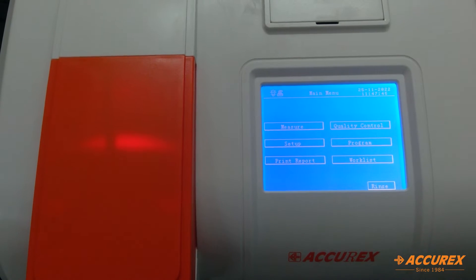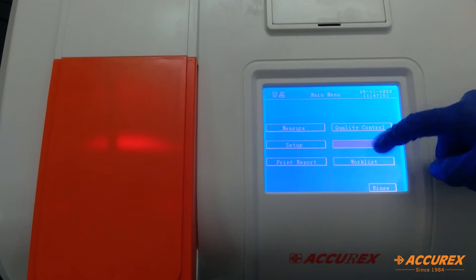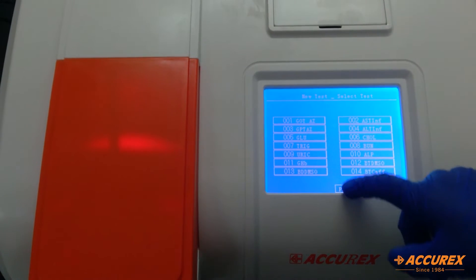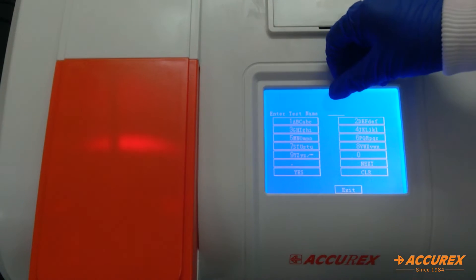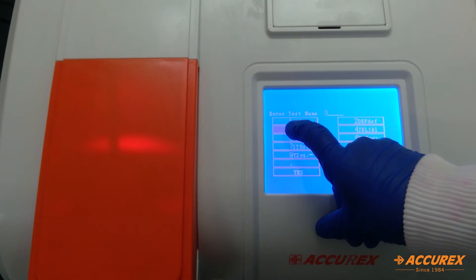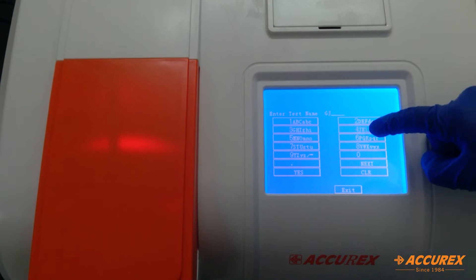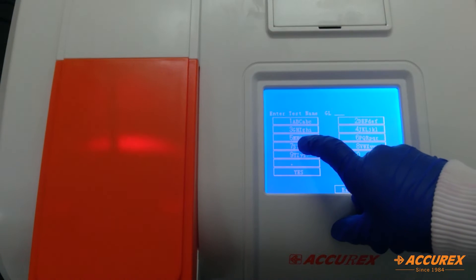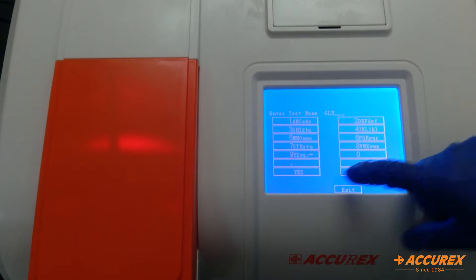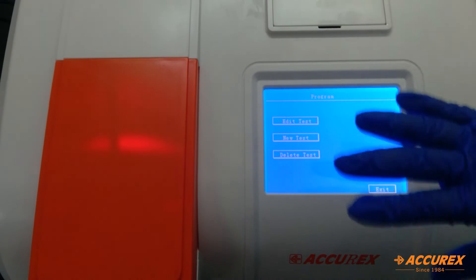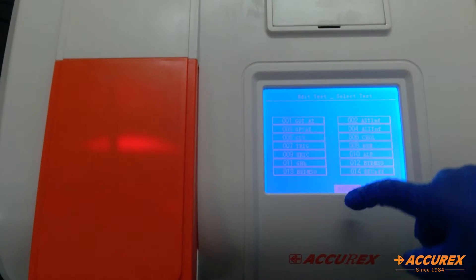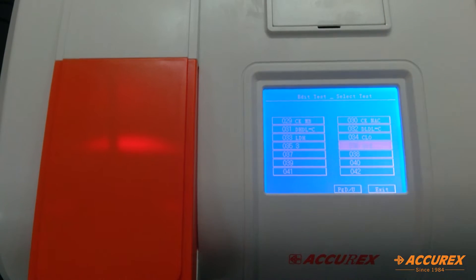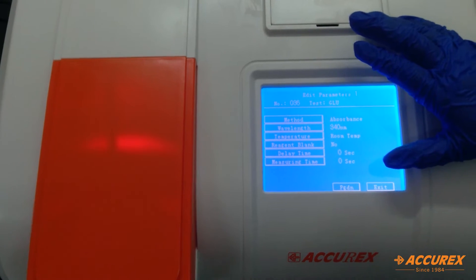Many of the programs are already fed in the analyzer. But if you want to create any new program, you can click on this and new tests. Here you can see all the tests. We'll click on page down and we'll see for the empty slot. Now we will enter the test name that you want to put. So you have added the test. Now you need to edit it. So we'll click on edit. We'll go to the name that you have created, that is glucose, and we'll edit according to the pack insert.